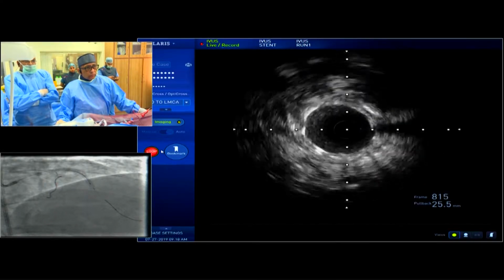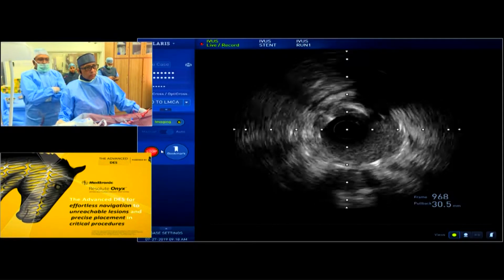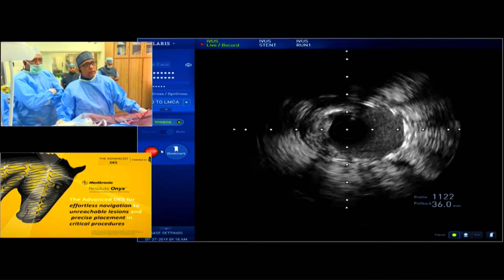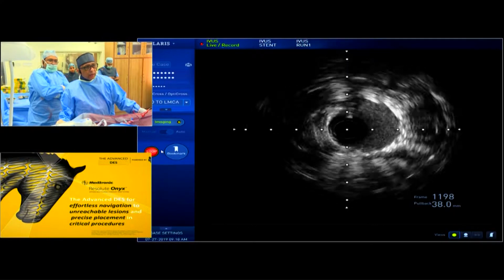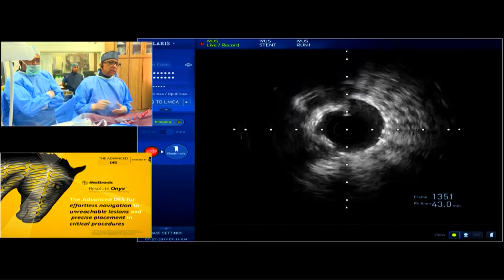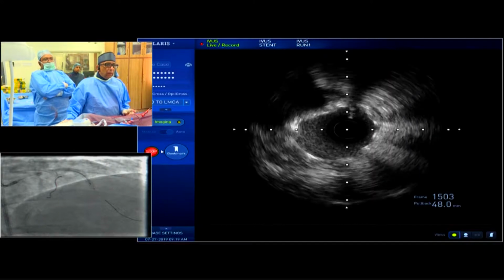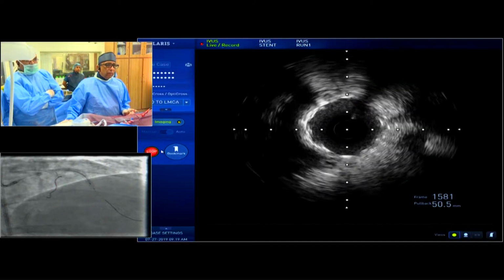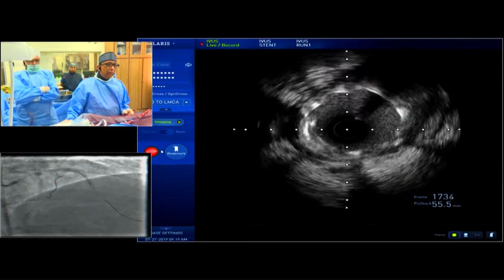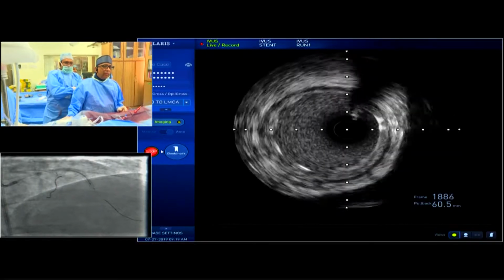2.1 to 2.2. Even with a 3.5 millimeter post-dilatation, you got only 2.5. Yeah, maybe. But there is a slight muscle bridge there. I expected that, otherwise the stent would have been crushed. Usually that is a strategy. Even if you take a 3 millimeter balloon stent, when you do an IVUS, you see maximum 2.5 with the same stent, and if you post-dilated 3.5, you may get 3. That's all. Now there is some under-expansion there. That part.